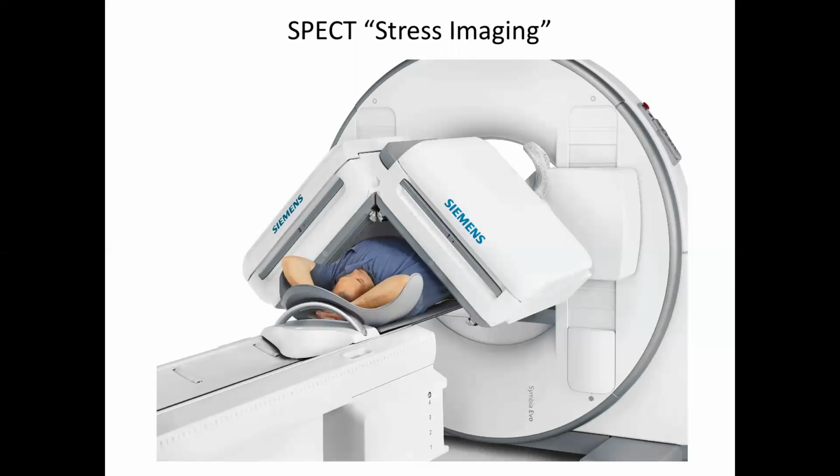Again, here's what nuclear medicine looks like when you're imaging somebody's chest. We have injected an agent into the person such that they are glowing. And most of the time, say for body SPECT, or single photon emission computed tomography, the energy of the photon that will come out of the patient is 140 keV. And it's a gamma ray. It is at the top end of X-ray energy that you create with an X-ray tube, actually 140 keV.